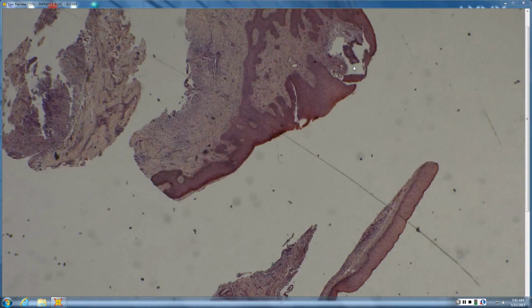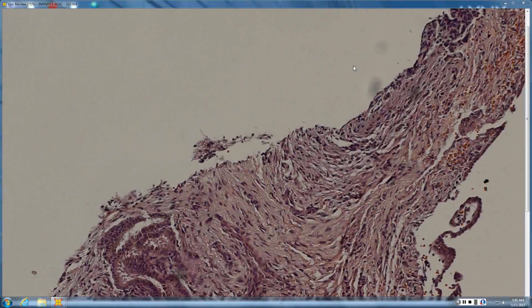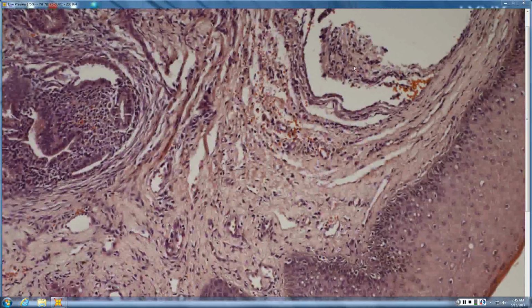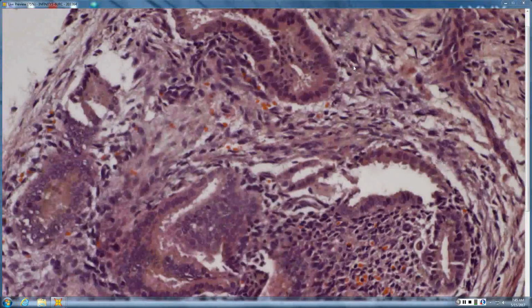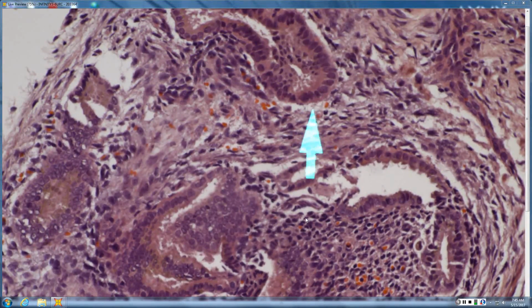Looks like trying to see if this was mucosal. Probably skin rather than mucosa. So the dermal deposit here looks almost glandular, and columnar, some cuboidal, large. Kind of puts you in the adenocarcinoma type. Looks sort of like there's decapitation secretion. I'd say there's not necessarily much crowding or disorder.